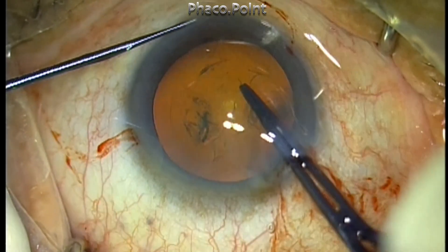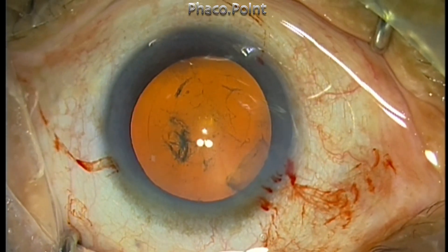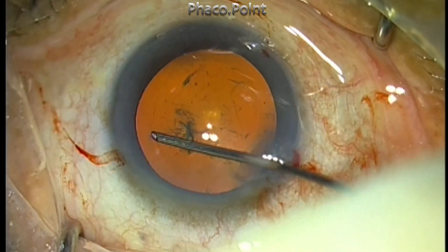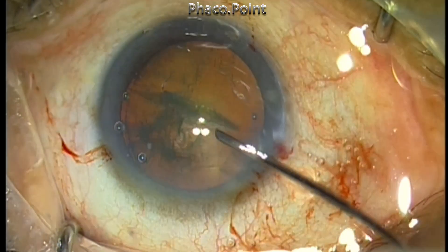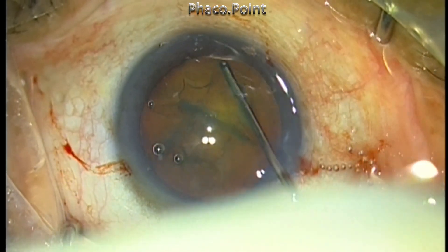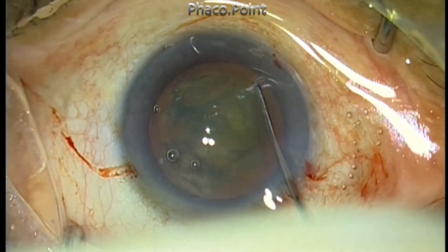So after performing the capsulorhexis, I really did not foresee any problems, having handled many such cases. I tried to do the hydro dissection and I see a nice hydro dissection wave. However, on attempting the hydro delineation, which I'd like to do in softer cataracts, I found that the hydro delineation wave did not happen very well.